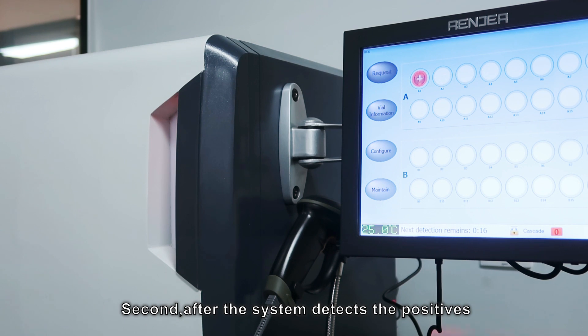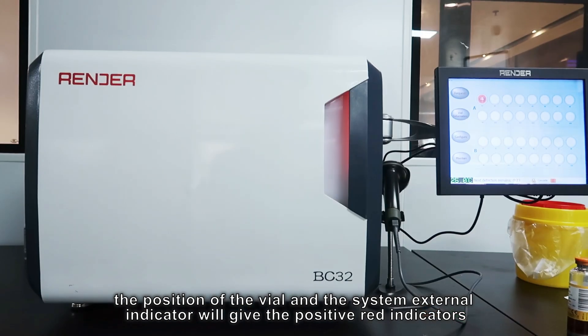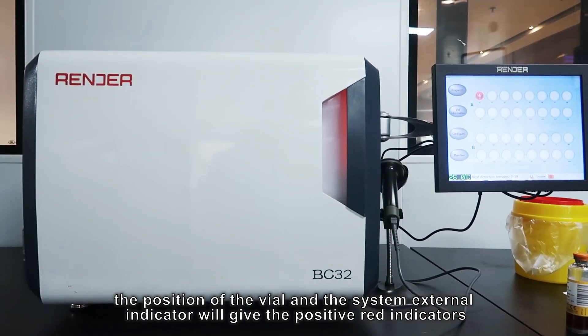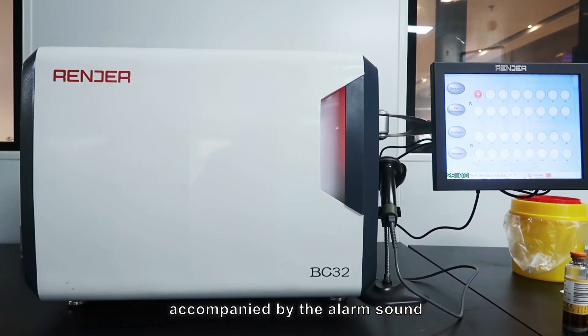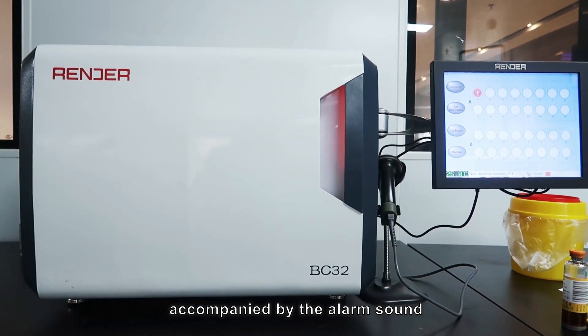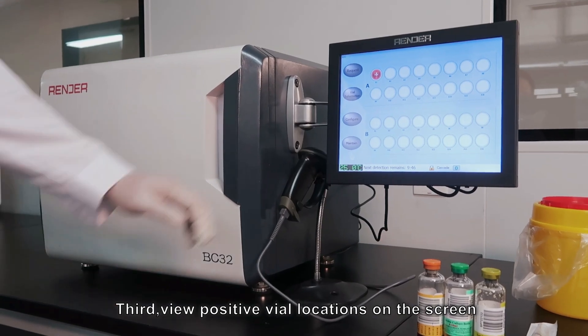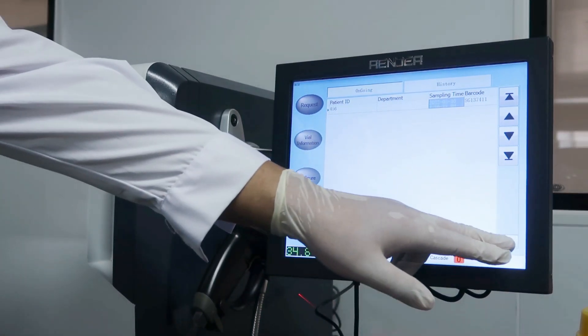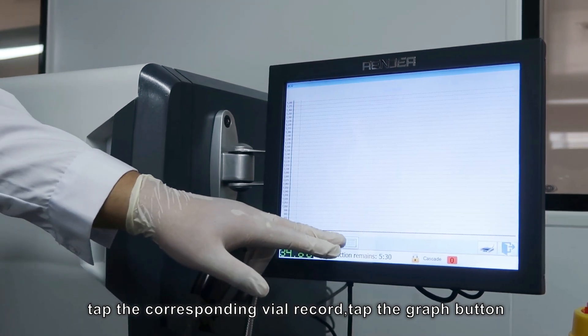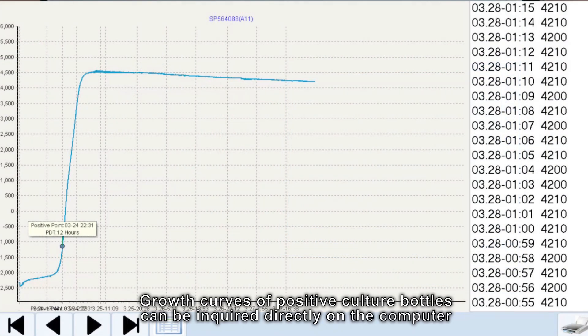Second, after the system detects the positives, the position indicator and the system external indicator will give the positive red indicators, accompanied by the alarm sound. Third, view positive bottle locations on the screen. Click the bottle information button on the left side of the screen. Click the corresponding bottle records. Click the graph button. Growth curves of positive culture bottles can be inquired directly on the computer.